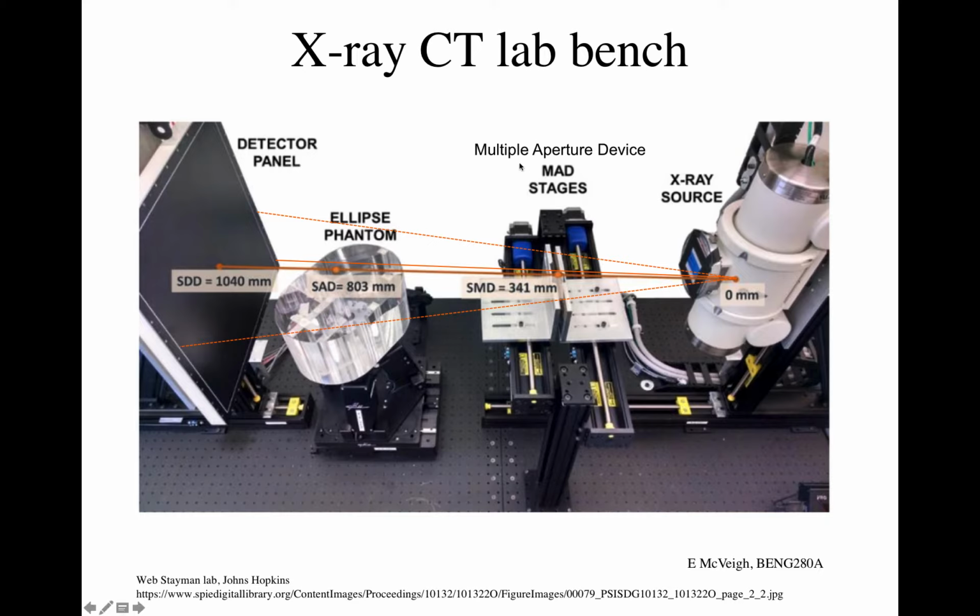Oh, this guy? Yeah. Well, basically it's taking a beam of a certain intensity as a function of space, and then instead of making that uniform intensity as a function of space, if you have some knowledge of the object and I need more X-rays over here than I do over here, it makes sense just to put more X-rays over there and not over here, right? And so it will modulate the X-ray beam if you have some information about what it is you're imaging. For example, if you're imaging multiple frames of the same thing, right?